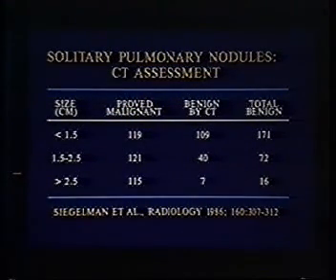Both these authors recommend that when you're using CT to try to diagnose nodule calcification, you use it only on nodules that are less than 2 or 2.5 centimeters in diameter to try to avoid the possibility of calcified carcinoma and calling a malignant nodule benign, because there are simply too few benign nodules in the larger nodule group to rely on.